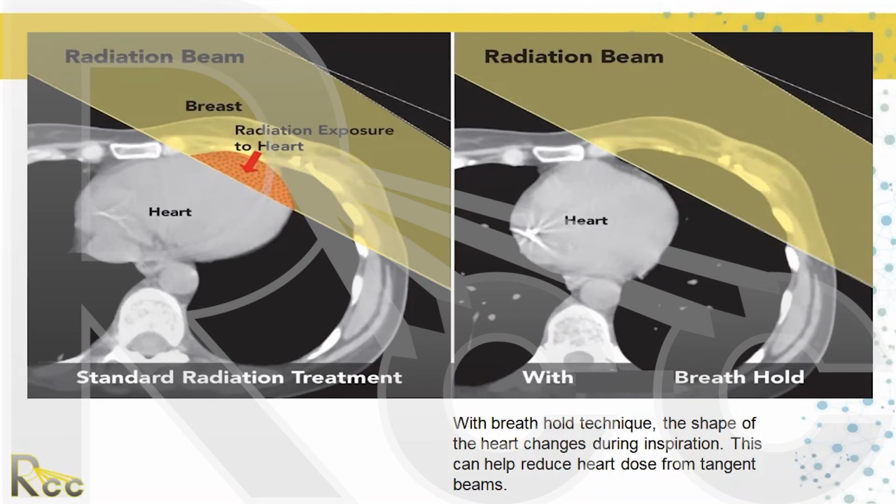Okay, another question, please. I think Ty just put something in the chat. Okay. Ty just said the advantage of cobalt is only mechanical and it's durable. Does not have any dose coverage advantage like head and neck CA. Yeah, I don't see an advantage with cobalt for head and neck with linear accelerator.